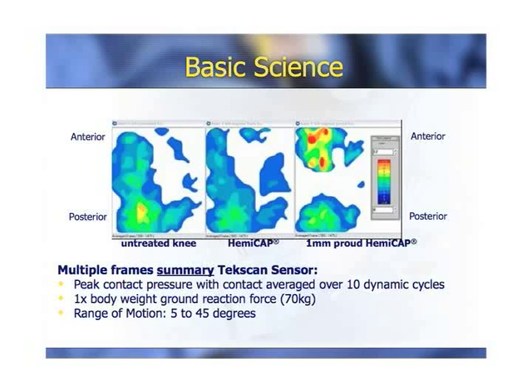Also, what's important to note is when the implants are recessed, the question of a metal coming into contact with normal articular cartilage is answered, in that the stresses experienced are normal, meaning there's no significant difference. This is one study that was done, and the Tekscan data was basically identical, but you only needed to be 1 millimeter proud to see a significant jump in the joint contact pressures.